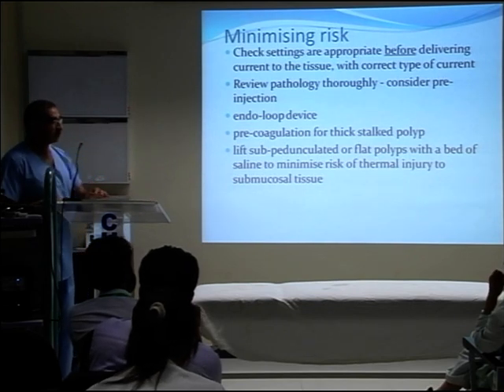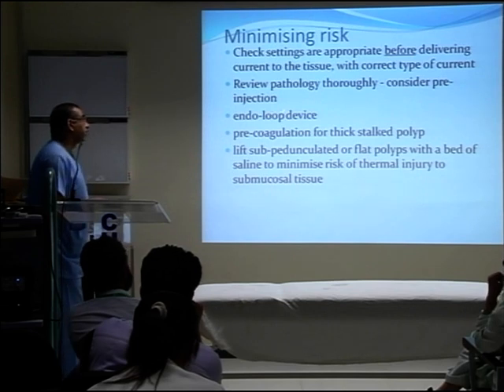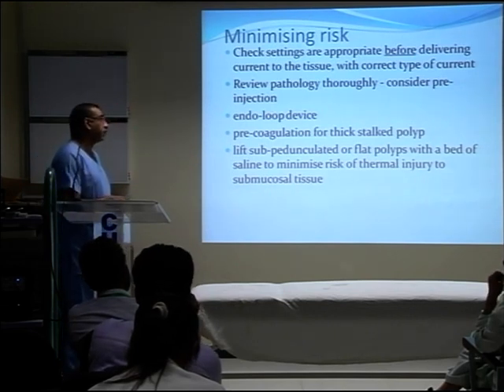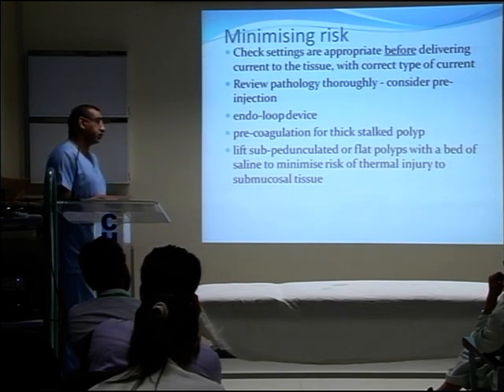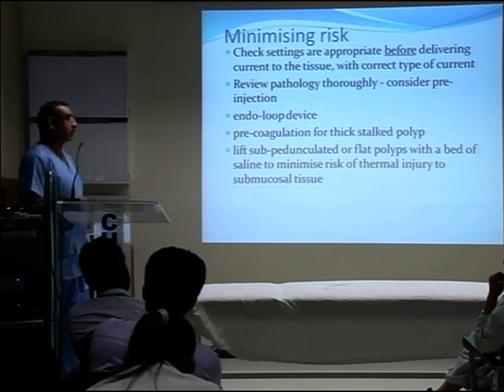How much injection do you give with adrenaline? Blanching is what you're looking for a little bit? No, if you are using EVR, endoscopic epinephrine volume reduction, then use about 10 mils in total. So 3 to 4 mils into the stalk and 3 mils into the head.